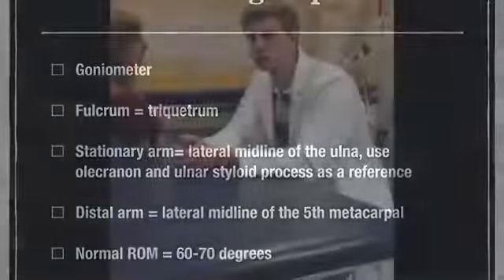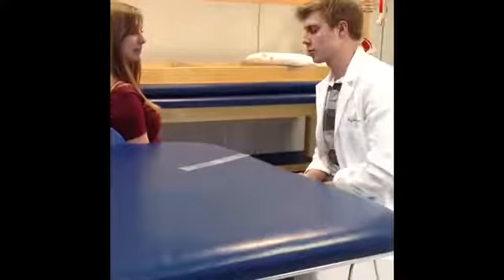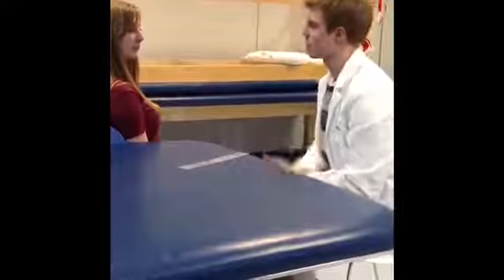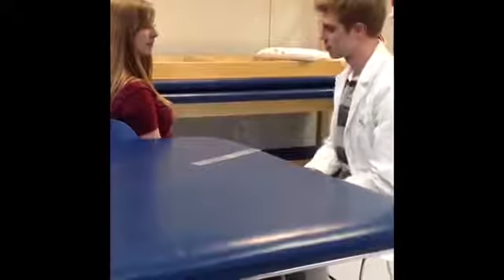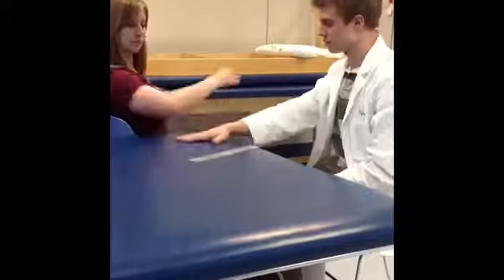Hi. Today we're going to demonstrate how to measure wrist extension using a goniometer. So first things first, you're going to ask your patient to get in the optimal test measuring position. So if I could have you put your elbow on this table here.